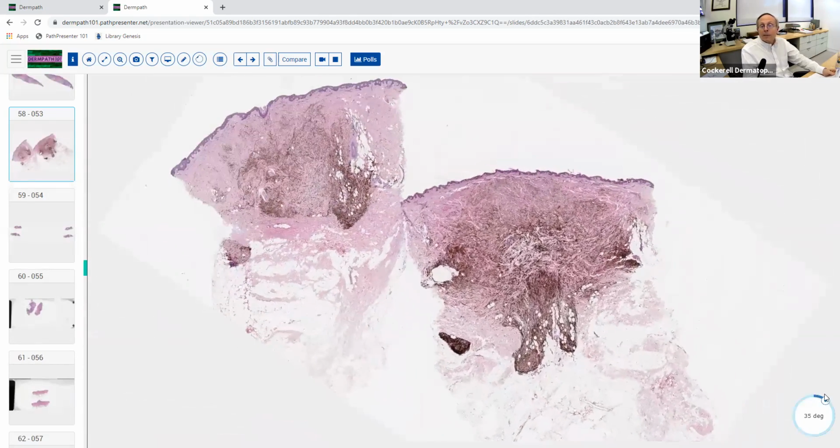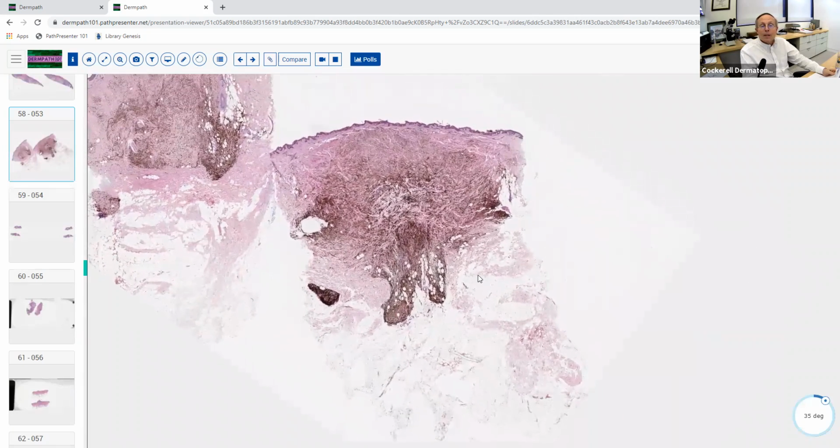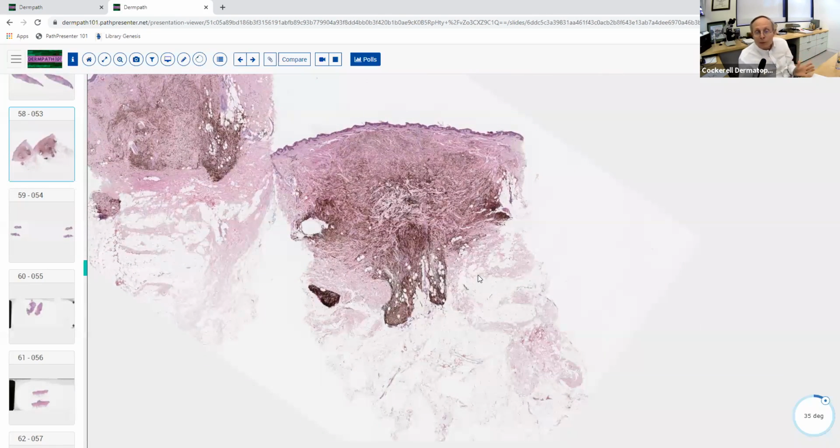All right. Excisional biopsy. Inflammatory or neoplastic? Clearly neoplastic. What kind of differentiation? It's dark, melanocytic. So, is this epithelial or non-epithelial? Well, you can argue that. People think melanocytes may be epithelial cells, if you will, neural crest, but it's melanocytic. The melanocytic category right away.